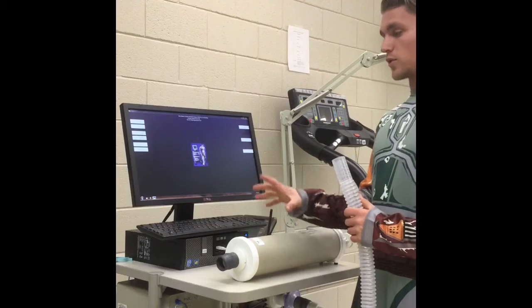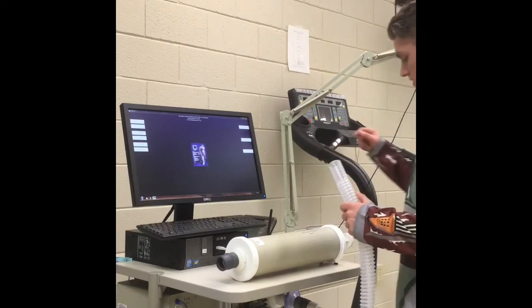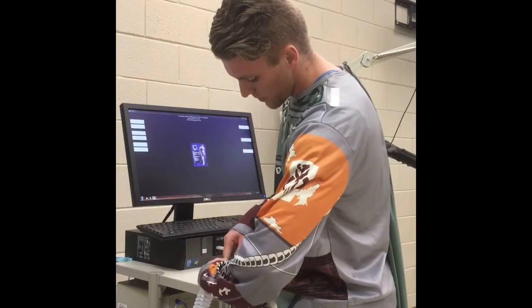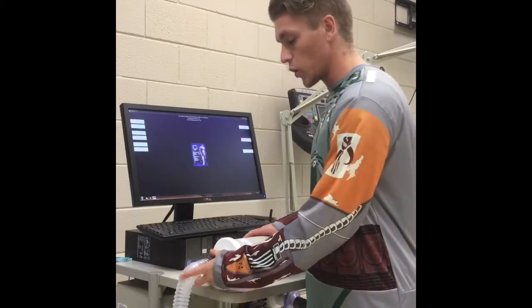Next we are going to do the flow meter calibration. Take the 3-liter calibration syringe, which acts like an artificial lung. Take the tube that is hooked up to the Parvo and connect them the same way as before — pinch slightly to place it in. It should be secure with no wiggle room.